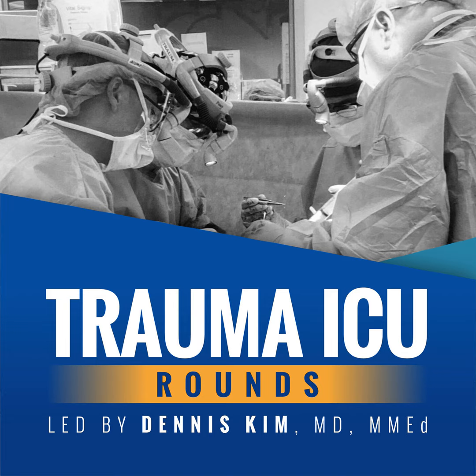And that was identified in a multi-center trial that randomly assigned 526 patients receiving ventilation to undergo SBTs using a T-piece for either 30 or 120 minutes, and the rates of weaning failure and reintubation were virtually identical in both groups. And so if 30 minutes is an adequate test and provides you with the same accuracy of data as a trial that's 4 times as long, why not just stick with the 30-minute trial, assess your patient, and if they pass, then we're going to move on to the final question or the fourth objective.